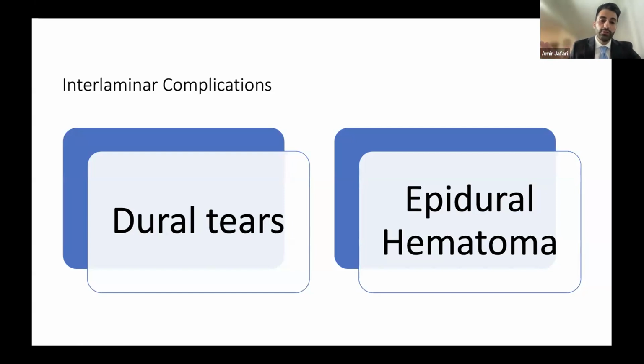You use a sealant, it's like a glue. You put it on the Duragen and you slap it onto the hole. You want to make sure there's no nerve root sticking out. That can paralyze the patient or cause incarceration of the nerve root.